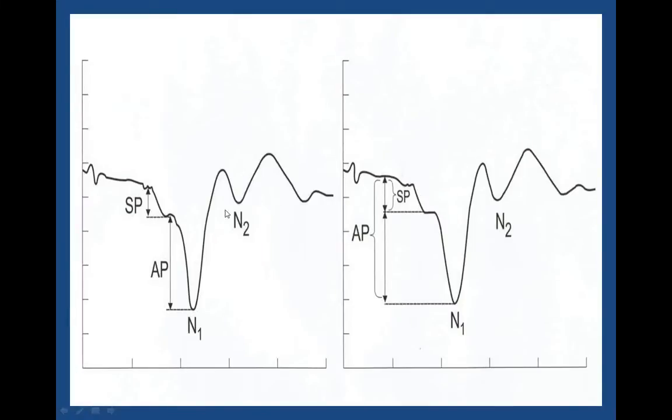But with extratympanic recording, and even the tympanic membrane is considered extratympanic since it's outside the middle ear cavity, we have found the use of the absolute amplitudes measured this way to be a more stable way to do it because the baseline tends not to be as stable and linear as this one is here. You all know that when we show tracings like this and say they're representative of the ones we get, that means they're probably some of the best we've ever seen in the 10 or 15 years we've been doing it. But we all do that.